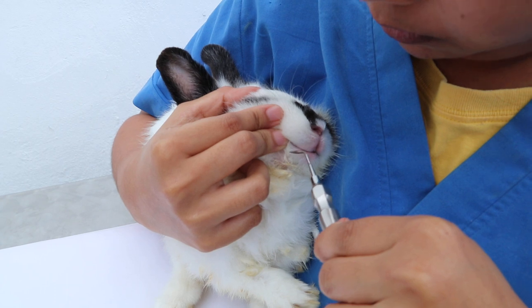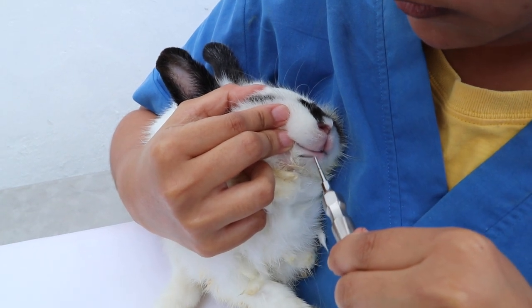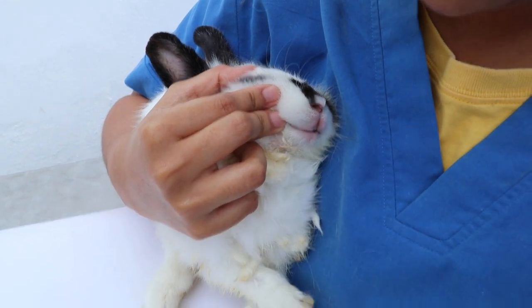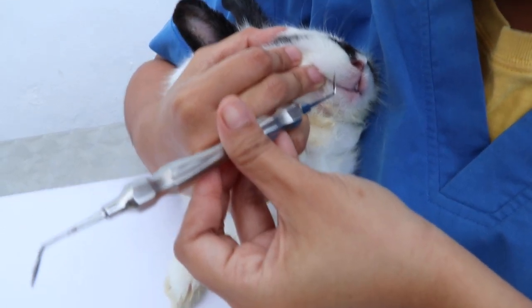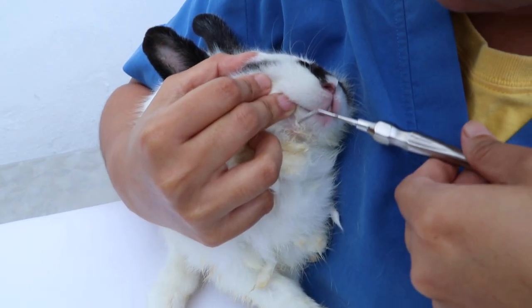The molar luxator is used to loosen the ligament, especially for decayed teeth. It comes in different angles — one is for the right side and one is for the left.